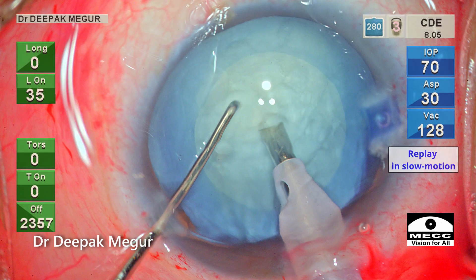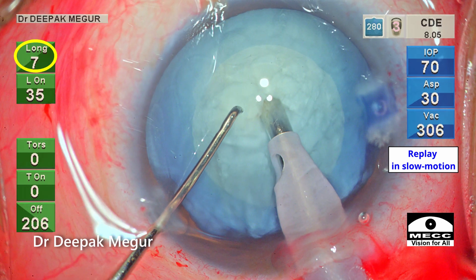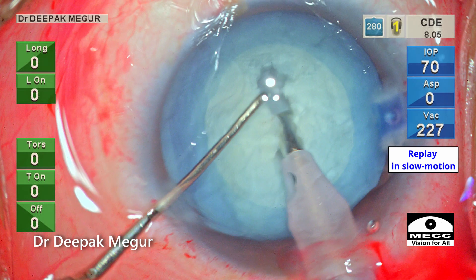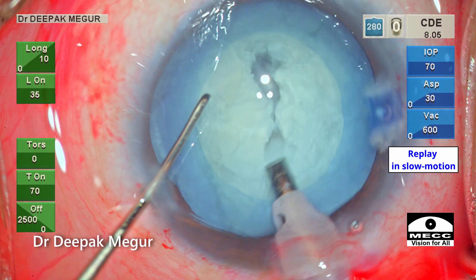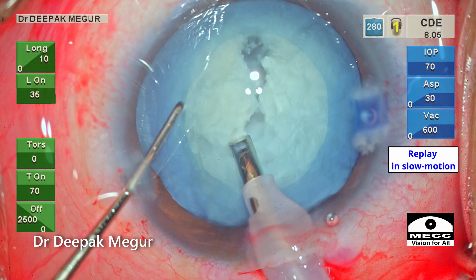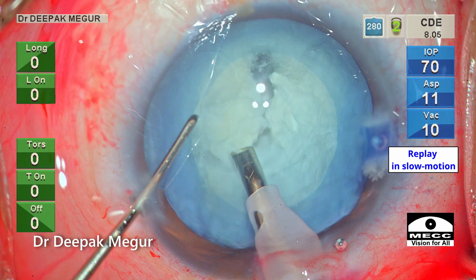Now let us analyze this in slow motion replay. As the foot pedal is being pushed, the energy has not even reached a level of 7%, and suddenly we can see this jerk and a full-thickness-looking hole is created in the nucleus. The message was very loud and clear — the low energy which I thought was right for this density of cataract was still considerably high for this nucleus.